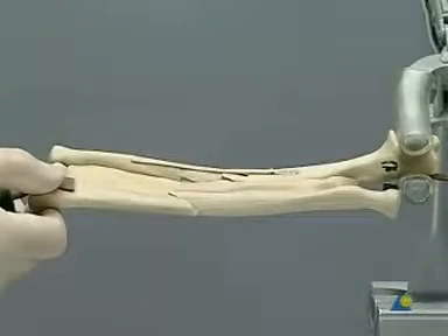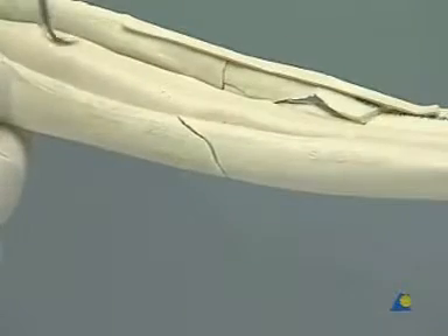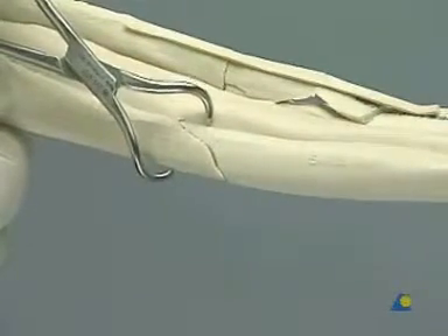Place the model in the vise as shown. A pointed reduction forceps is used to hold provisional reduction of the radial fracture.